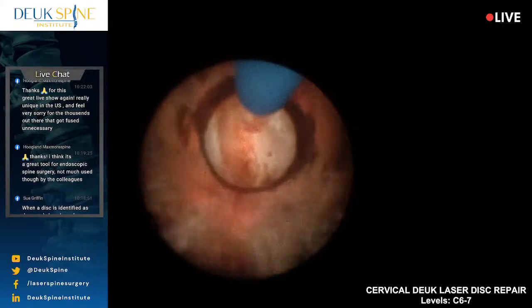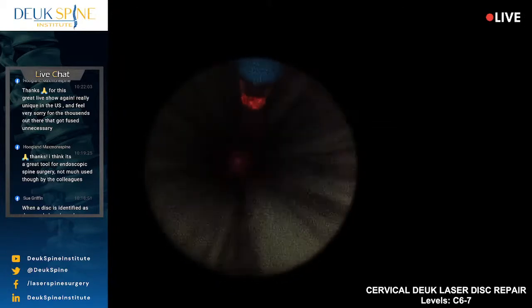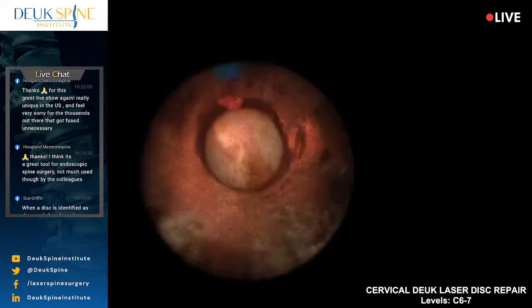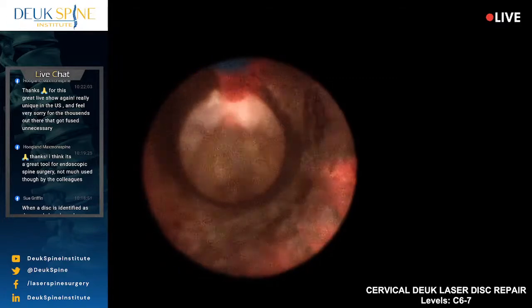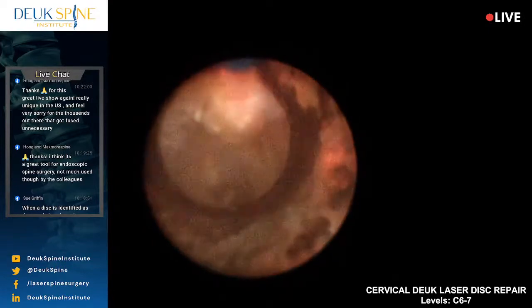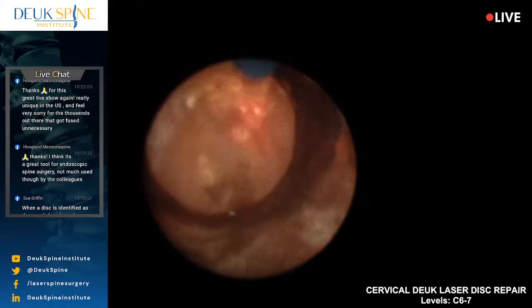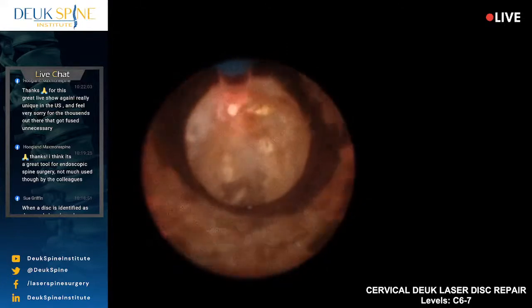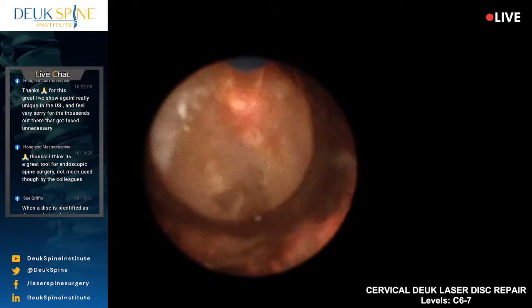I feel like I've taken as much as I can safely. I don't think there's much left. So let me just look one more time out the foramen, and we're going to be done soon. Again, I saw my technique. I pulled backwards, and then I came in and I go down onto the bone spurs and calcium. Look how nicely the laser vaporizes all that. Very, very bad stuff, you know?